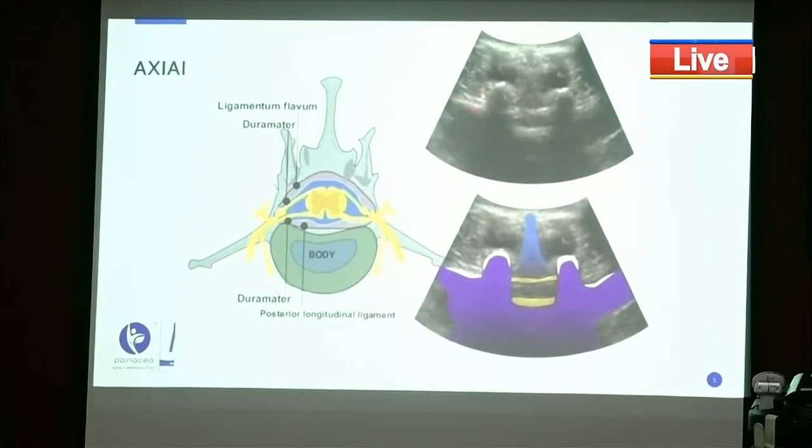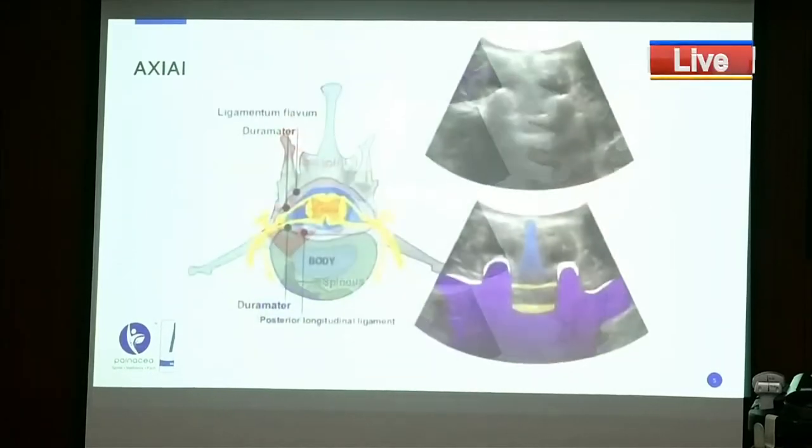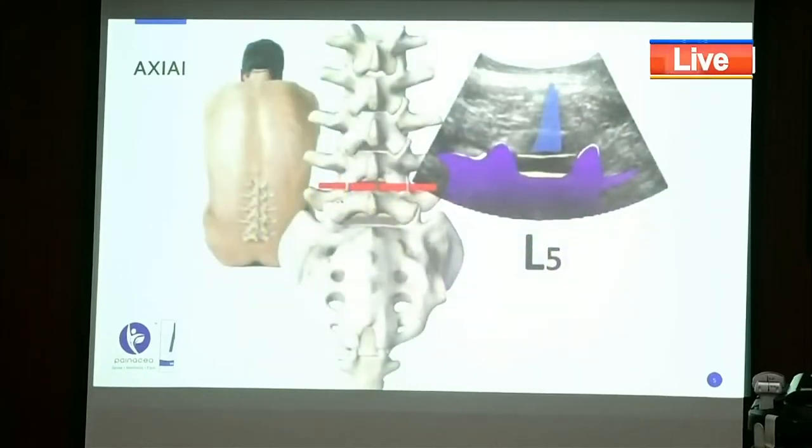Okay? Now, what we are going to see now is the bone which is coming from here, and then also there is a continuity which is maintained, and this structure can now be called the SAP. So the key here is to see a kind of continuity and angle being made here, which was absent in the last picture. Okay, so now you see this is the continuity which is not being made. You can see there is no continuity here. It is not the same shade as this one, more or less. Now those of you who can't appreciate because it's too small, I'll show you on the live patient, and also you start doing it yourself. There's no rocket science in it. Once you start doing, you'll start understanding.